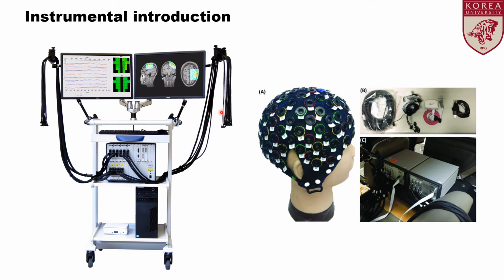These sources and detectors are connected with the NIRS device by fiber optic wires. These wires are very delicate, so the user should be very careful to use them. If the user shows some carelessness, he can break the wires.